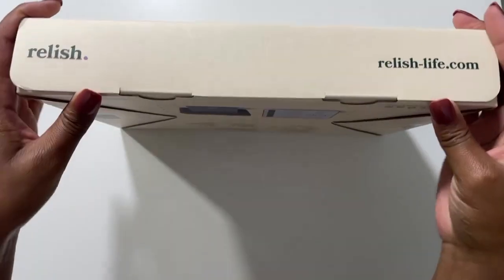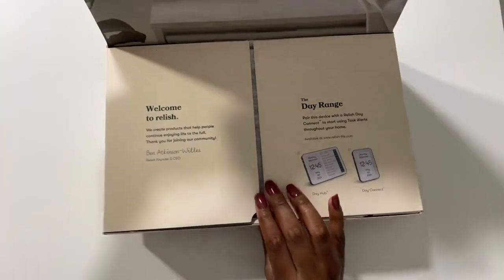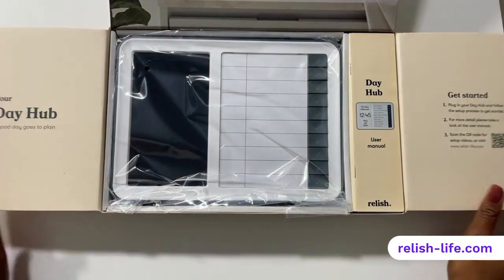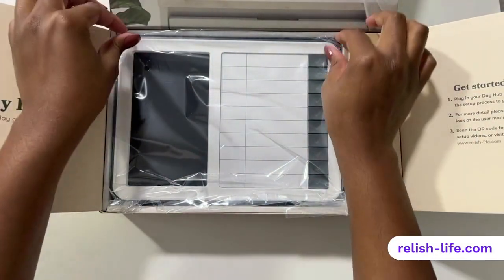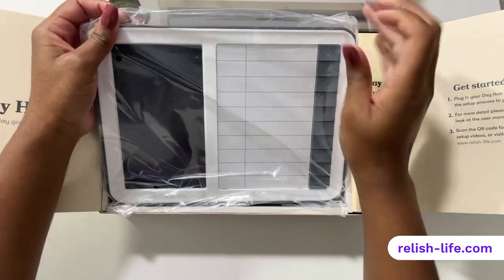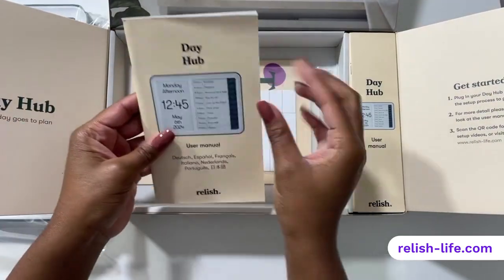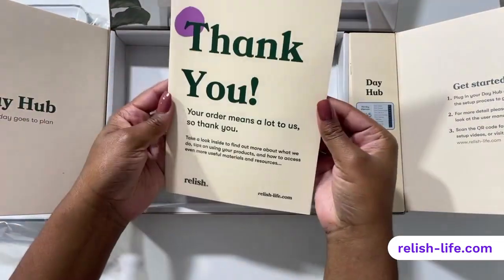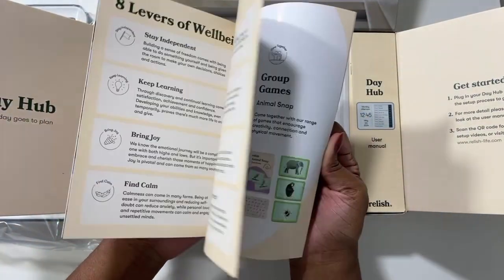Let's set up the DayHub Dementia Clock by Relish. Once we open it up, in the main section of the box we have the DayHub, the user manual for different languages, the task list cards, and a booklet to learn more about Relish and their products.